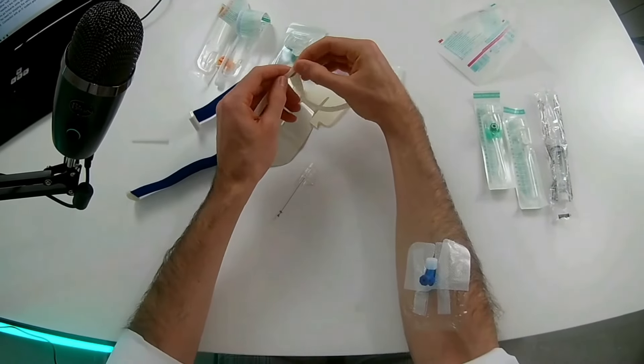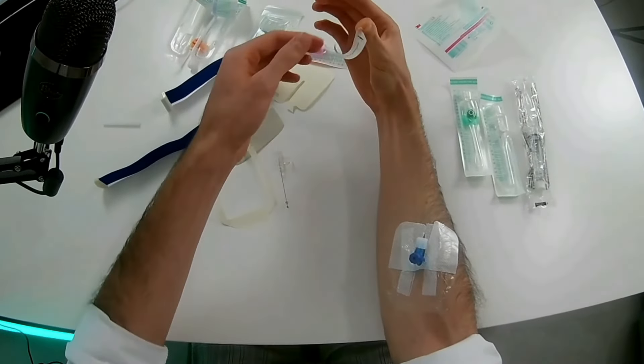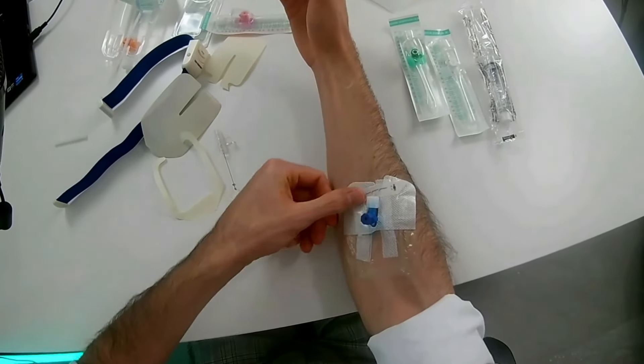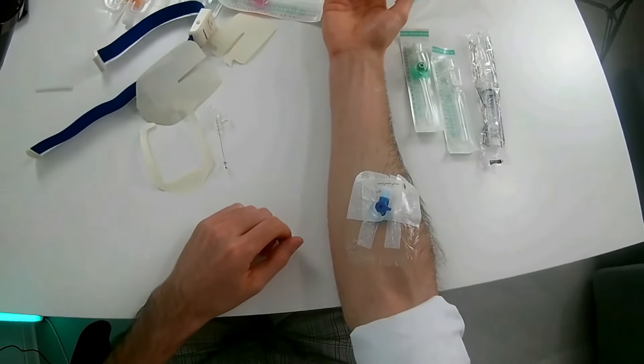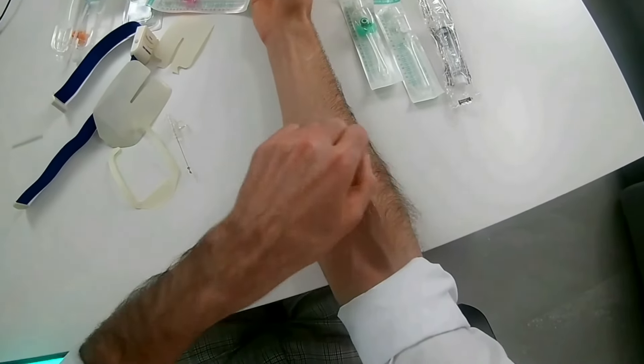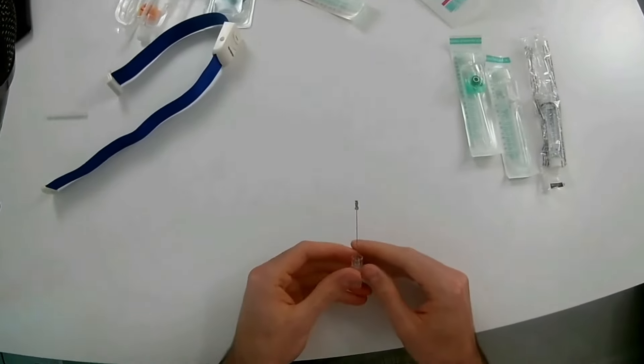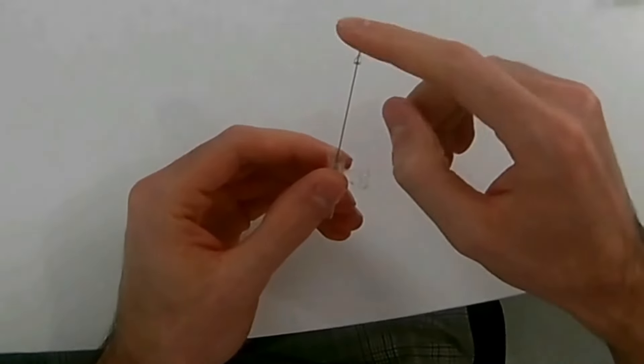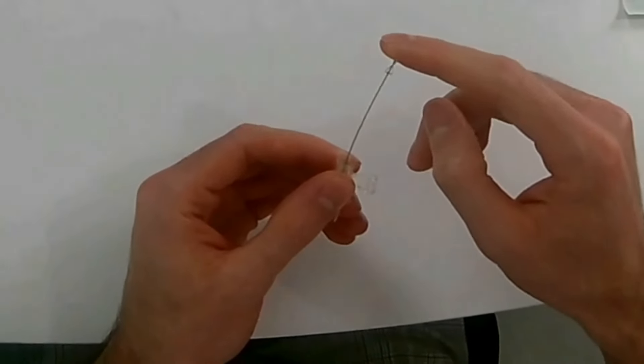And at the end, in this one you will write the date just to know when it has been done, and you close it. Now this is going to hurt. And by the way, the needle that you pull out has a special security system that prevents it from hurting you.